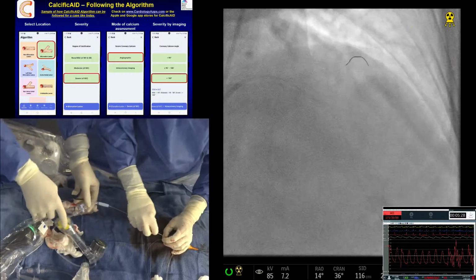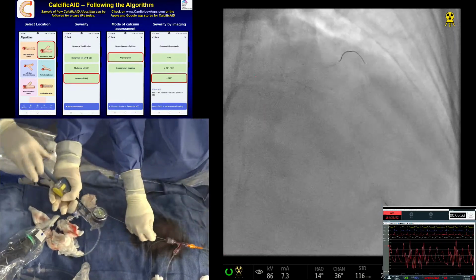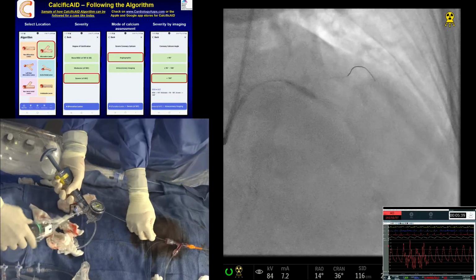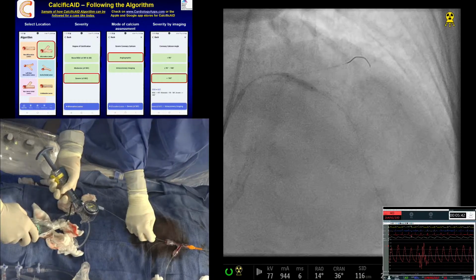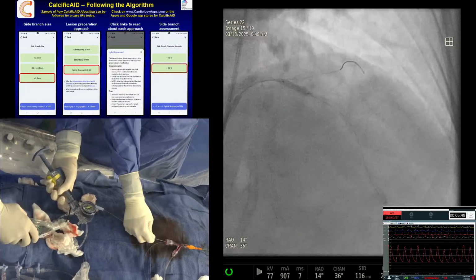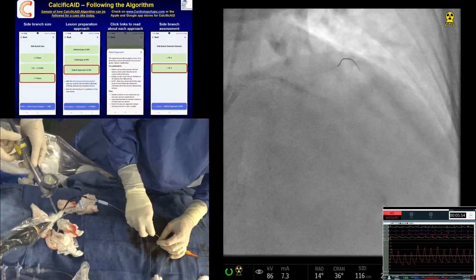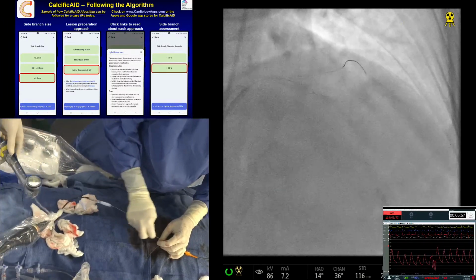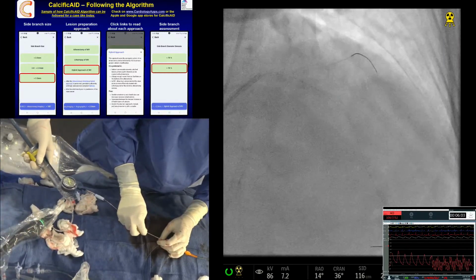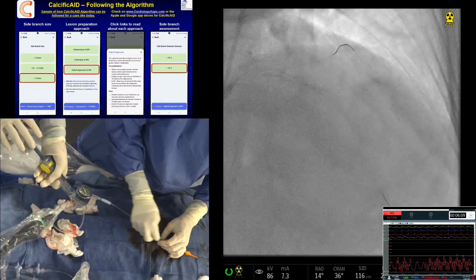Those are the app slides that we use to say what we can do. So now we are going with the IVL. A little bit more. No, it's still not going. I'm trying. No, it does not inch easily.